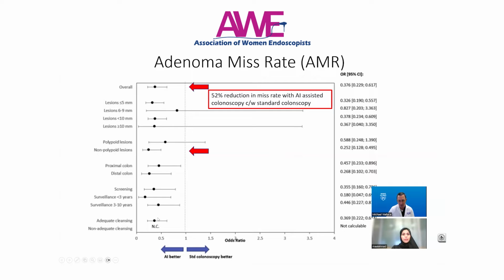We actually excluded patients who did not have adequate preparation. So it was obviously positive in those that did have adequate preparation. Now, these 2 trials led to the worldwide approval of this technology, both in Europe, the US, and including the hospital where Dr. Maryam Alahmad and I worked together in Sheikh Shakbut Medical City. And we implemented this system in our practice.